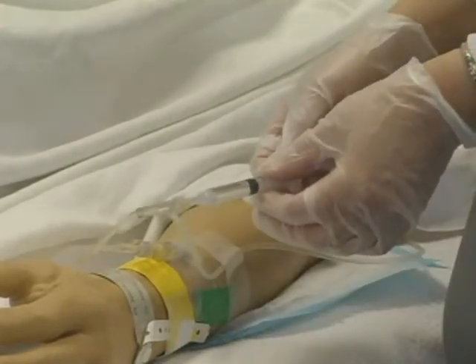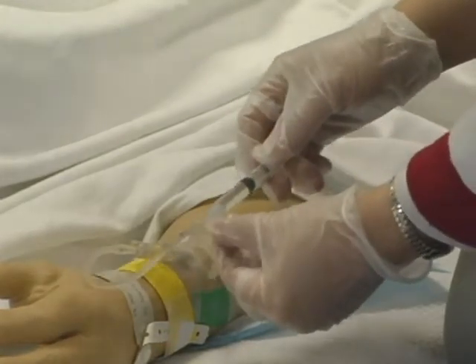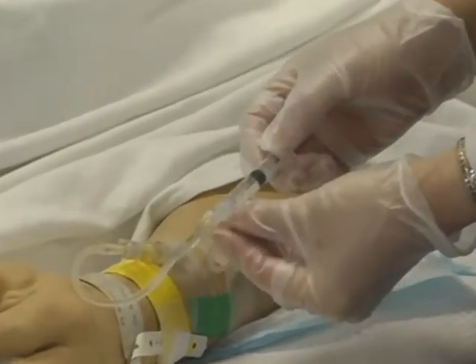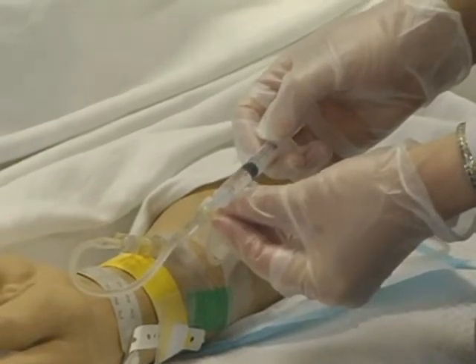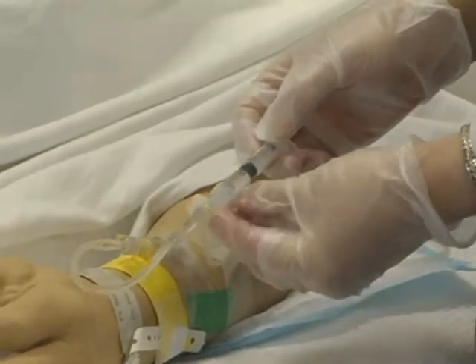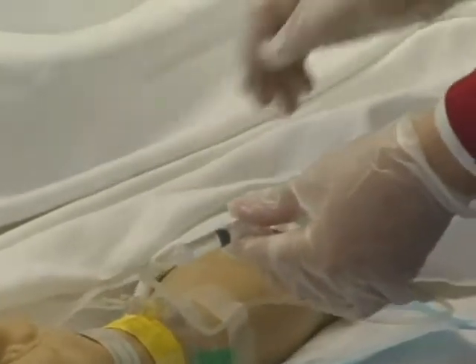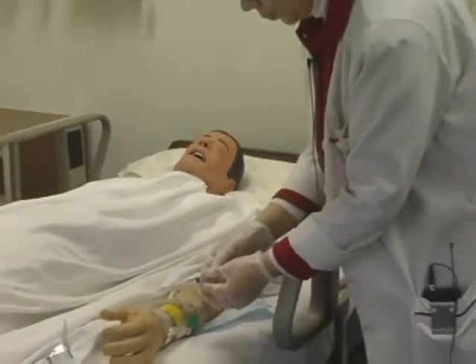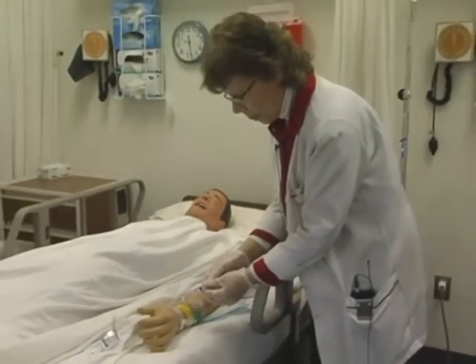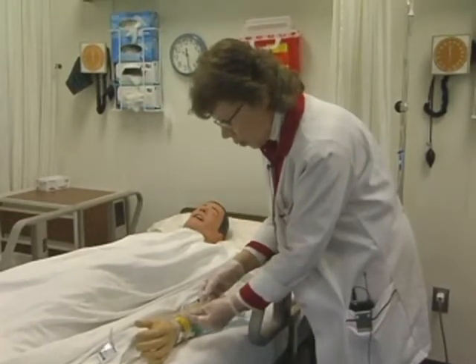And we calculated half an ml every 30 seconds. So I'm going to clamp the tubing, and I'm going to push half an ml. So I've clamped, I've pushed, I've released, and then I'm going to check my IV to make sure it's still dripping. And then I can time my 30 seconds by the clock. And when my 30 seconds are up, then I'm ready to do it again.